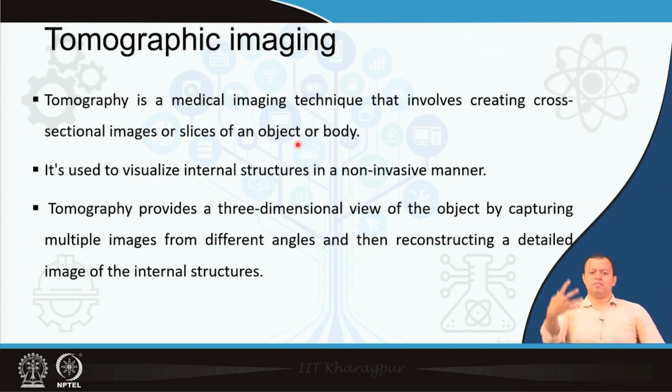Previously you used to have an X-ray just in front of you and they would take an image of your skeleton, but a CT scan is where the X-ray takes a 360-degree view of your entire body, and thereby a full 360-degree X-ray image. So, tomography is something similar. The T of CT scan stands for tomography.